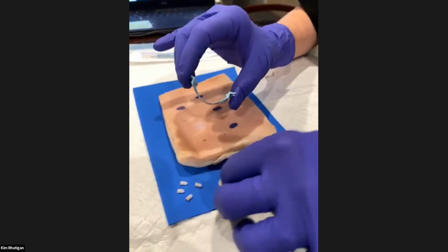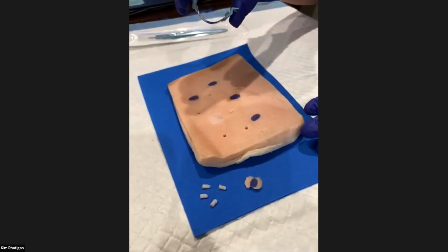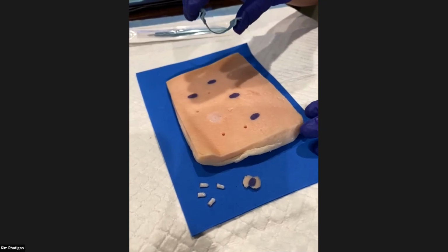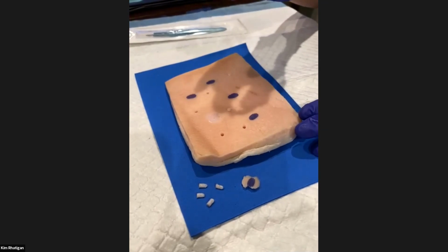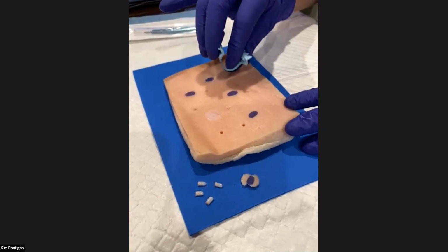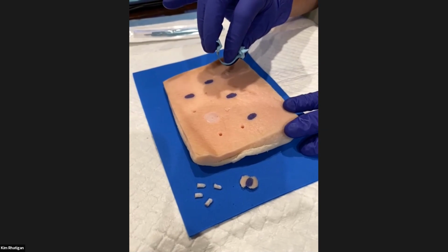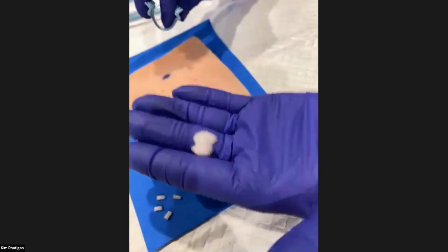That is true. And it'll bounce out. Now, you can do a shave excision. You can excise an entire lesion with a shave biopsy tool. In fact, Mohs surgery is a set of repeated shave biopsies. So if there's still cancer at the base, you can do another shave that goes deeper. All right, this is a pretty thick shave excision. Look at the thickness.